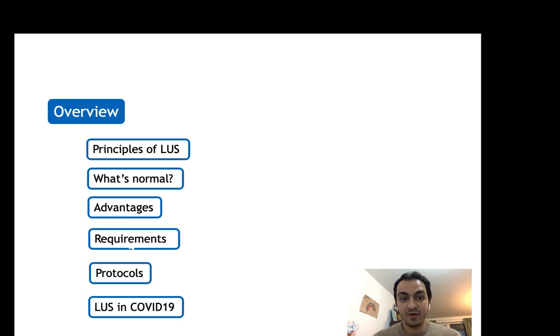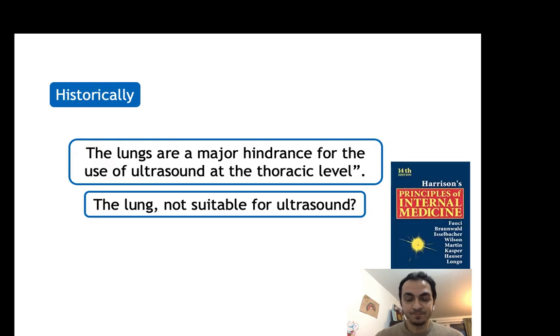that were found useful in scanning patients. And we will end by focusing on the use of lung ultrasound in patients with COVID-19, whether for the diagnosis, monitoring, and assisting our management of these patients.